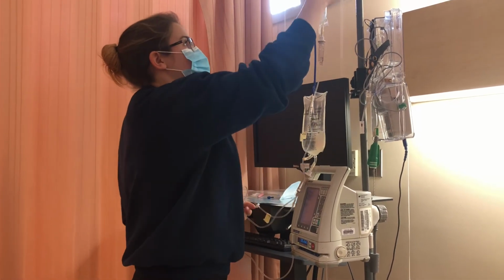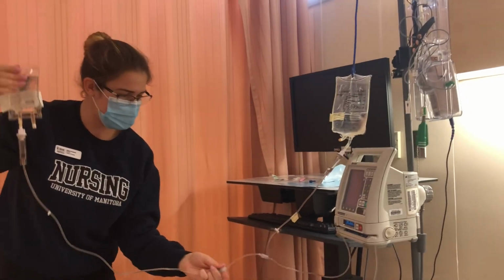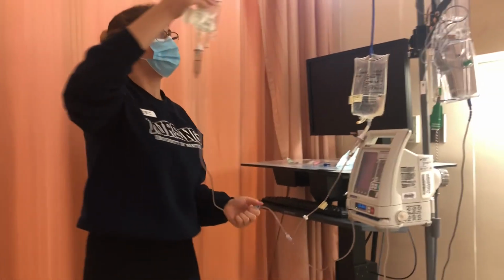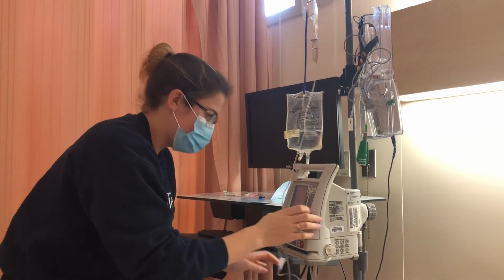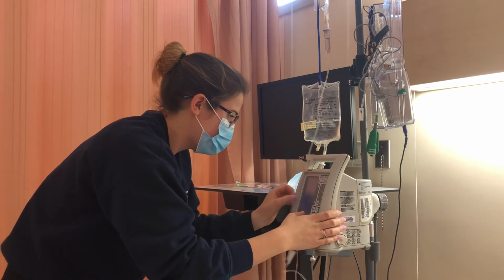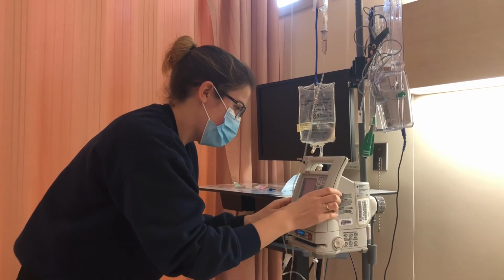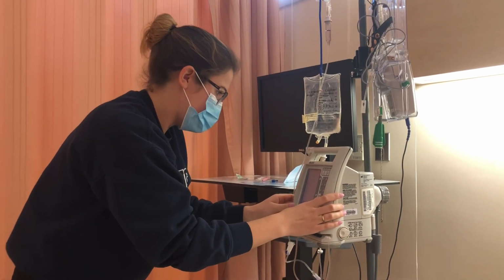Okay. So now I'm going to lower my secondary to back prime. So I'm back priming my drug. Okay, so there's no bubbles or anything in here. So now I'm going to open up all the, or I'm just going to program my secondary rate here. So I had 53 mLs per hour, and my volume is 53 mLs. I'm going to confirm secondary.